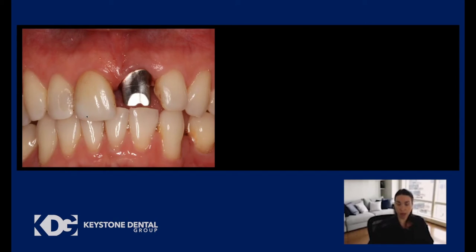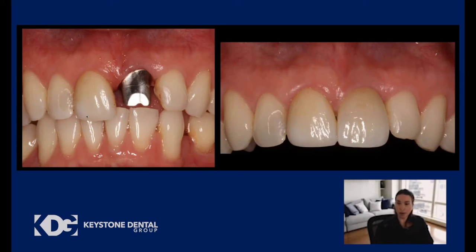The first one was gray, was delivered first, with a zirconia crown that was cement retained. At this point, the patient left, came back three weeks after for us to evaluate the soft tissue color. We wanted to allow the 3 weeks for the soft tissue to heal, for the soft tissue not to be irritated with the change from the provisional crown to the final crown.